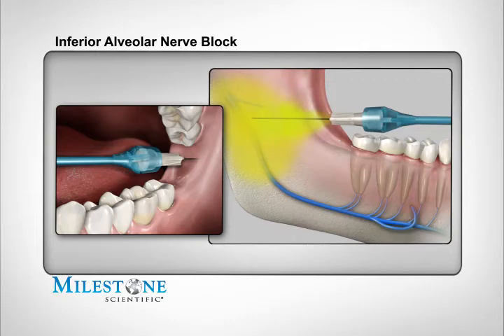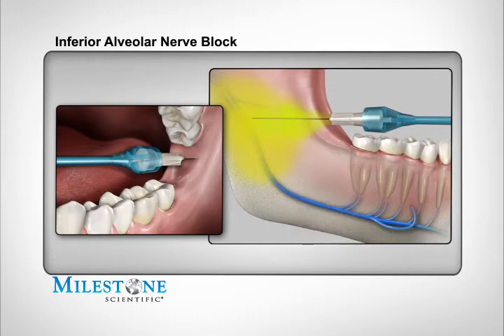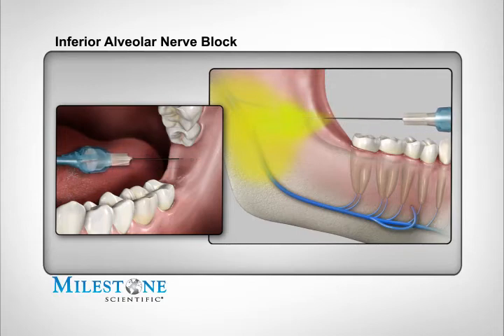When you've delivered the required dosage, you can remove the needle. To avoid anesthetic solution spray back into your patient's mouth, perform the following. While the needle is still embedded in the patient's tissues, depress and release the foot control pedal. Count 3 beeps after releasing the foot control and then totally remove the needle from the patient's mouth. Direct the needle away from the patient as a small amount of anesthetic solution may still be present.